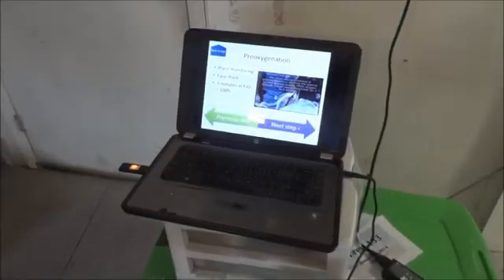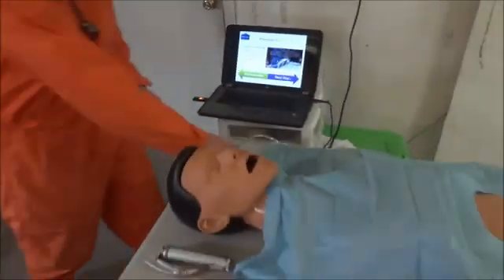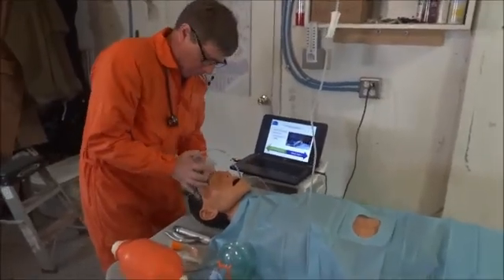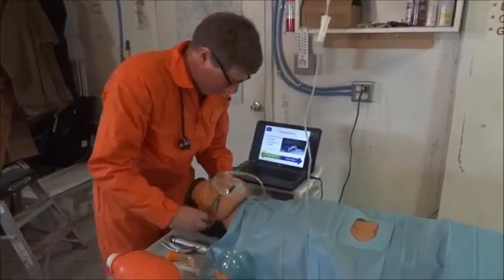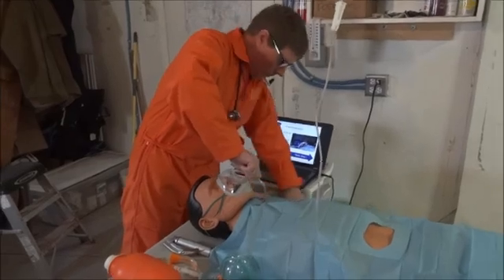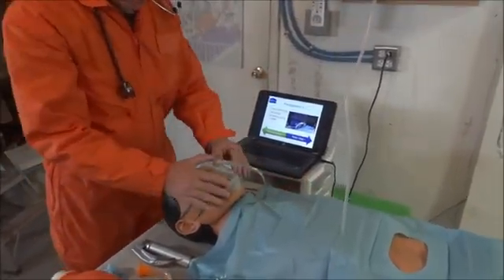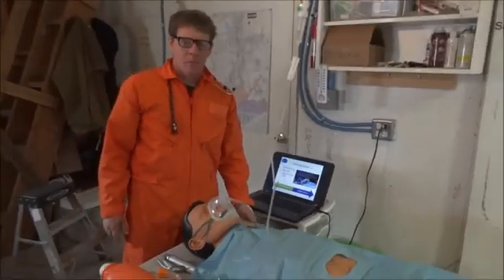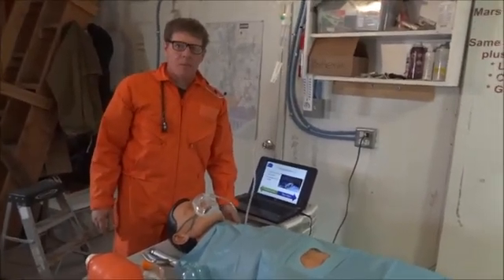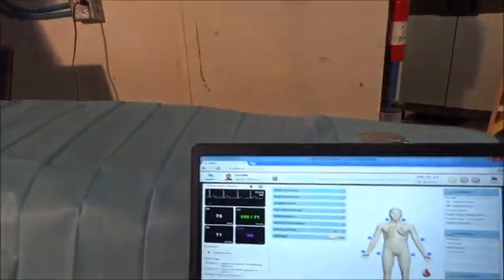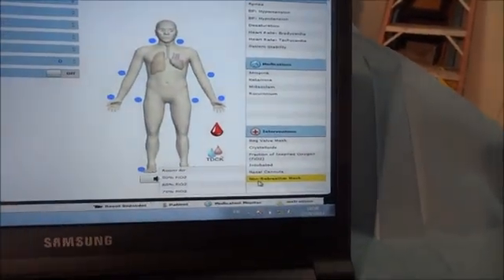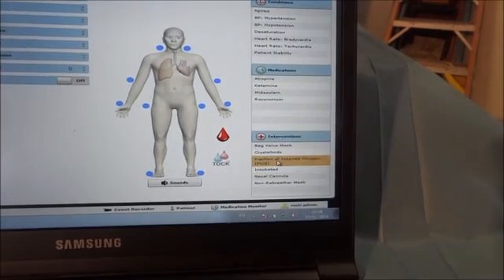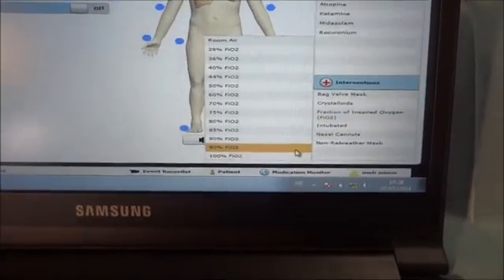The next step of the simulation is pre-oxygenation. The participant is required to give the astronaut some oxygen, in this case with a non-rebreather mask. He's going to have to leave the mask for at least three minutes in order to give enough oxygen to the patient before the induction. While the mannequin is receiving oxygen, on the simulator I'm going to select non-rebreather mask and then set the FiO2 to 100%.